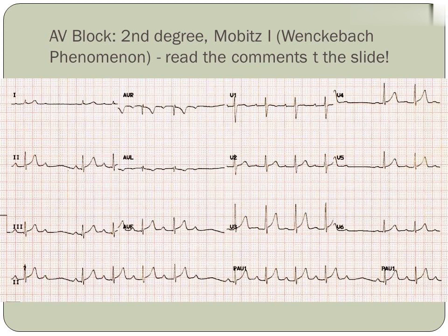The first clue to the presence of Wenckebach AV block on this ECG is the way the QRS complexes cluster into groups, separated by short pauses. This phenomenon usually represents second-degree AV block or non-conducted PACs, occasionally SA exit block. At the end of each group is a non-conducted P wave. The PR interval progressively increases from one complex to the next. The Wenckebach pattern here is repeating in cycles of 5 P waves to 4 QRS complexes, a 5:4 conduction ratio.